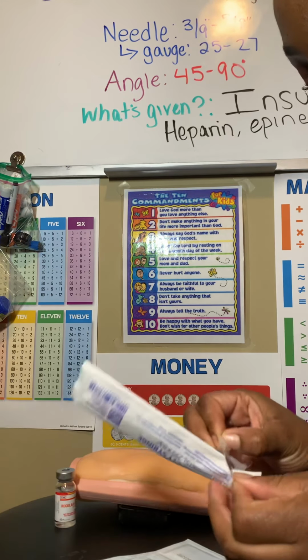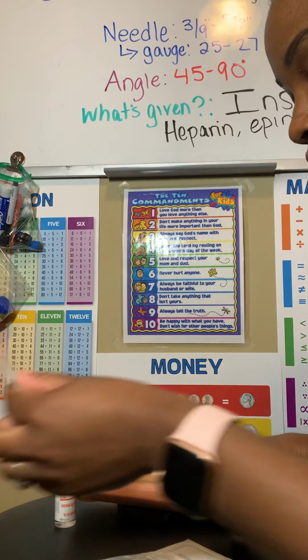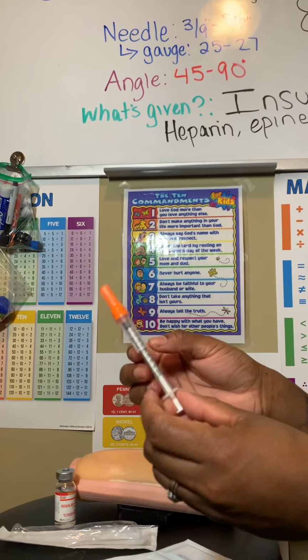Okay, so I want to actually show you an insulin syringe and how you can tell it apart from other syringes.